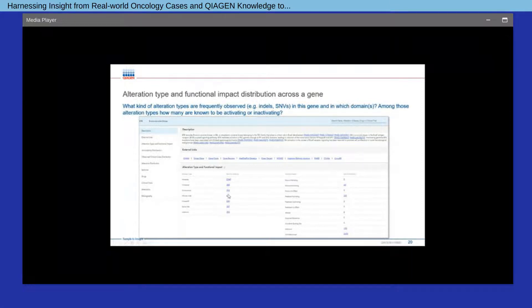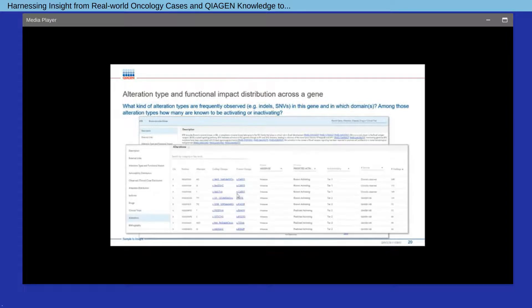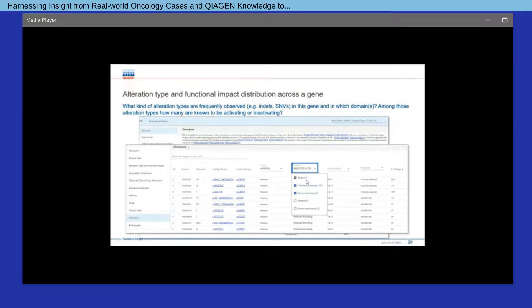The subsequent section provides an overview of alteration types and functional impact distributions. You can find out what are the known activating mutations by clicking on the number, which navigates you to the alteration section displaying those mutations known to be activating. You can also ask what alteration types are frequently observed — such as missense, nonsense, indel — and among a specific type, how many are known to be activating or predicted activating. In this example, we identified 400 activating or predicted activating missense mutations in BTK.